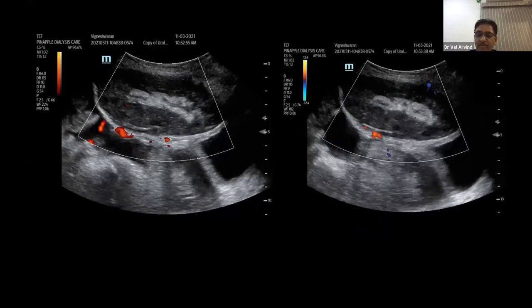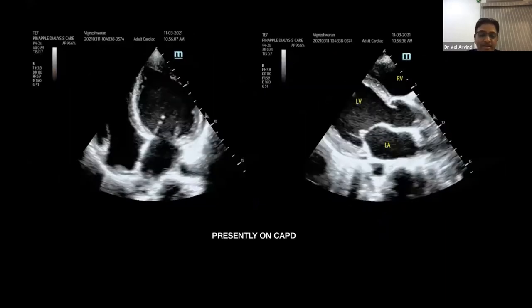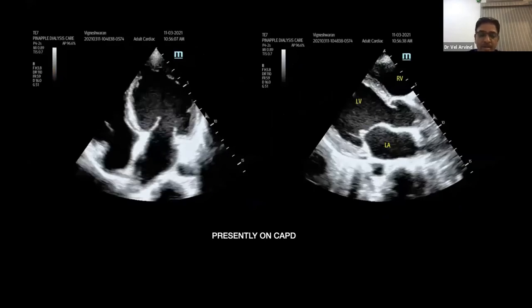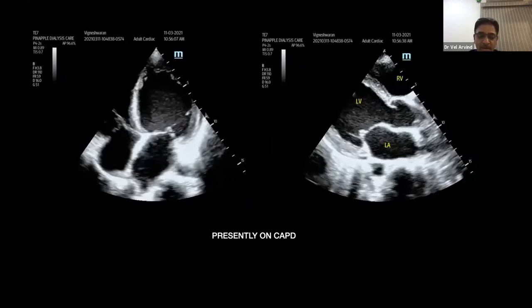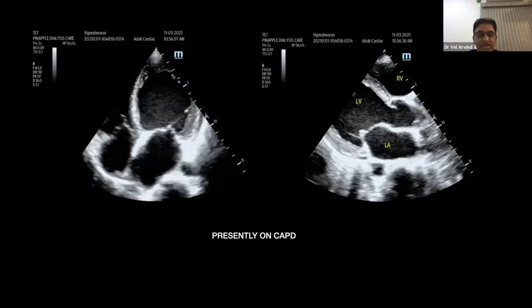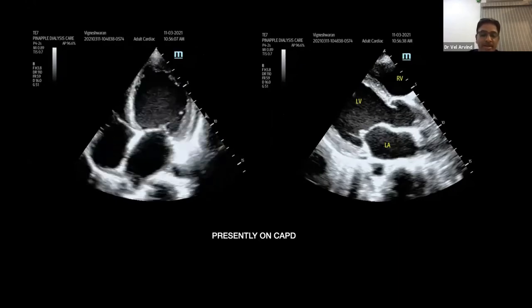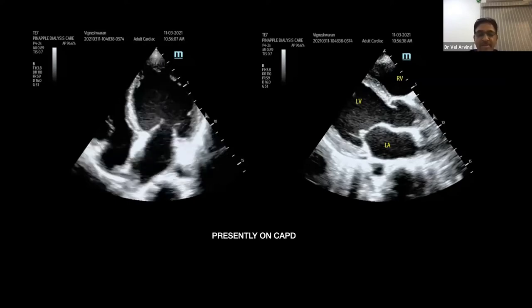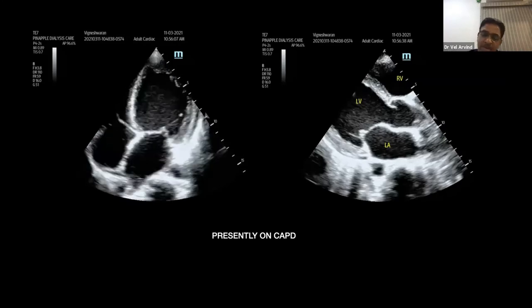There is some kind of fluid, the ascites is fluid. Here you can see the heart, how poorly it's functioning. The left ventricle is totally enlarged, severely dilated. One fortunate thing is the right ventricle, though there is TR, the right ventricle function is good. LA size is normal, so there is a little hope to fight on for this patient, right? The left atrium is the HbA1c of the heart. If left atrial size is normal, even with the LV dilatation, I still go with the transplant, because LA size decides the surgical outcome, anesthesia outcome and post-operative course, everything depends on LA size. The LA size is normal, I'm very happy about it.